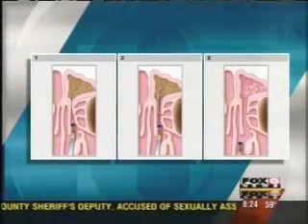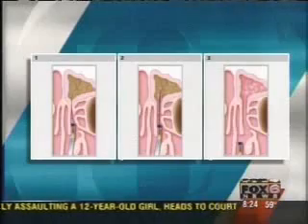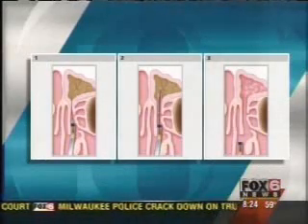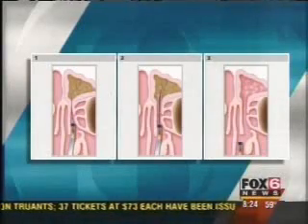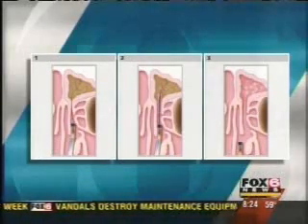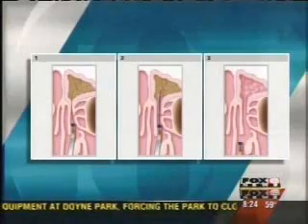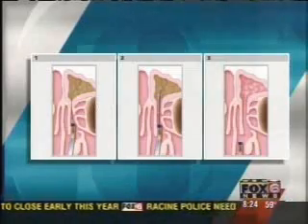What you're seeing on the left is actually the first thing we do in the surgery, which is introduce a wire into one of the sinuses, and then we place a balloon over that wire into the sinus opening. It's actually the natural sinus opening, and then we inflate that. And we're doing that all under radiographic imaging, so we're able to see exactly where we are in the sinuses. And as you can see on that rightmost picture there, when we open things up, the infection and inflammation is able to come out, and that creates a major difference for people.